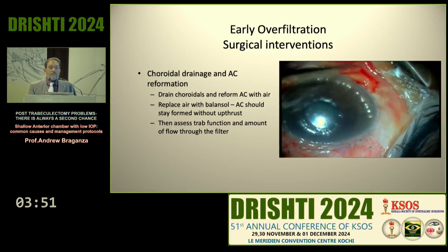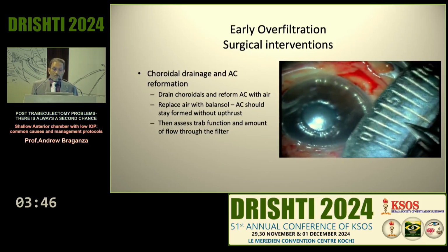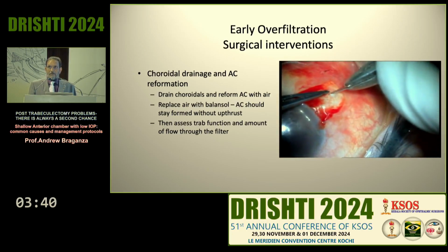The choroidal drainage is shown here, where it's a fairly simple procedure. You can't do it under topical; you do need to have a full peribulbar or retrobulbar block.